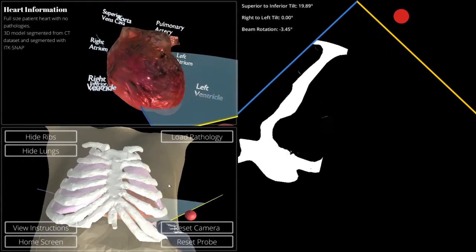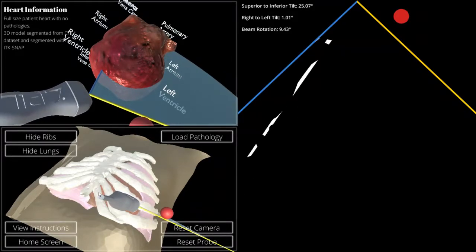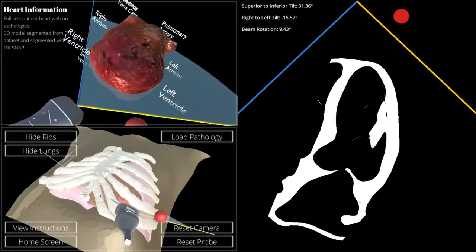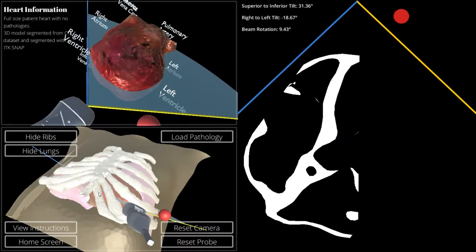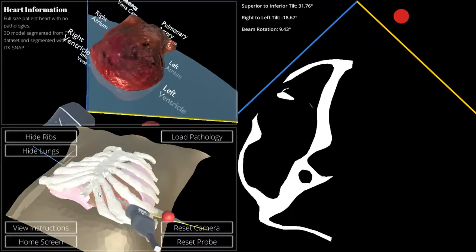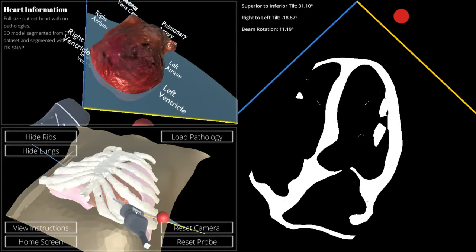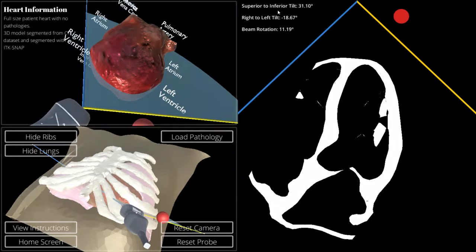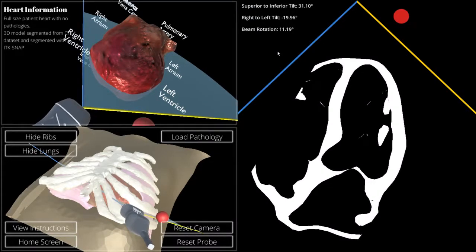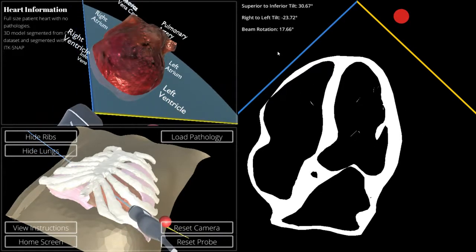However, if we were to try and get the apical four-chamber from the parasternal view, we can certainly do that by positioning it between these two ribs, moving the probe over a little bit, as you would in a normal exam, and then angling it up so that you get the four chambers that you actually want. And there it is. As you can see, our superior to inferior tilt, right to left tilt, and the beam rotations all change dynamically as well, so that you can always position yourself within the heart and know exactly where you are.